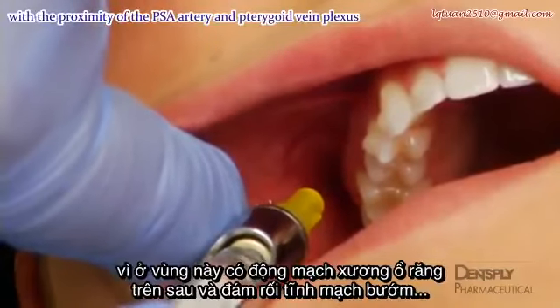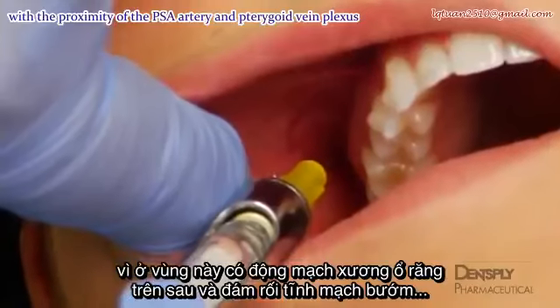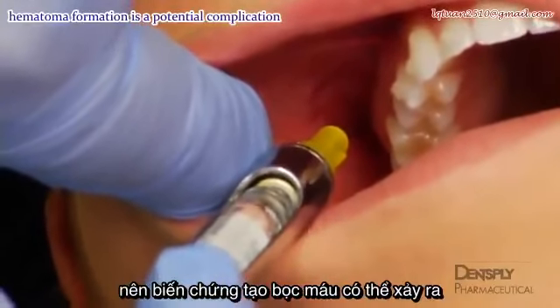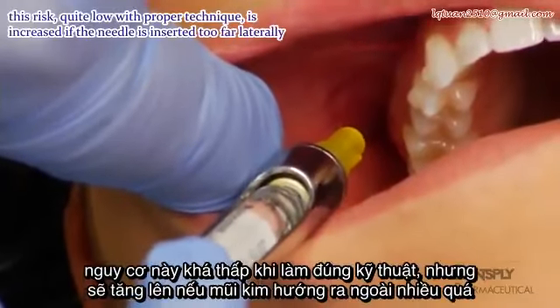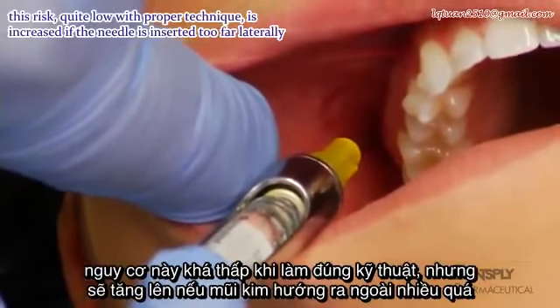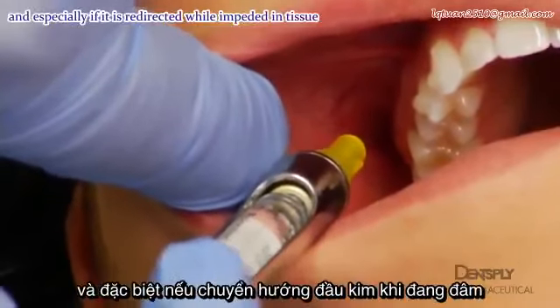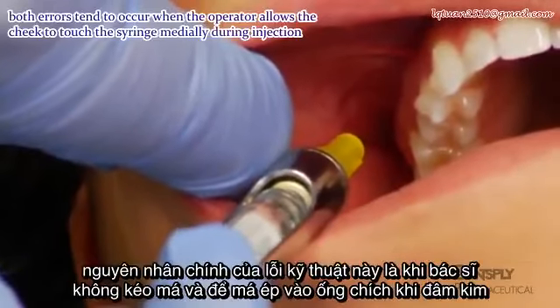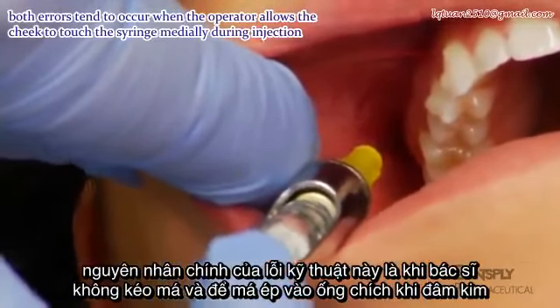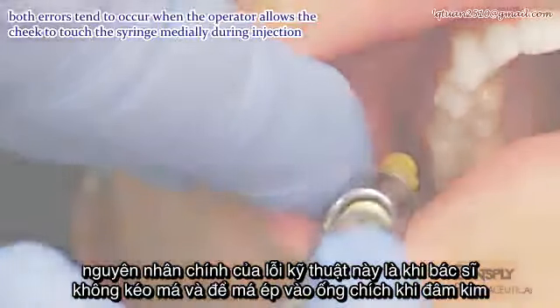With the proximity of the posterior superior alveolar artery and the pterygoid venous plexus, hematoma formation is a potential complication. This risk, quite low with proper technique, is increased if the needle is inserted too far laterally and especially if it is redirected while embedded in tissue. Both errors tend to occur when the operator allows the cheek to torque the syringe medially during injection.